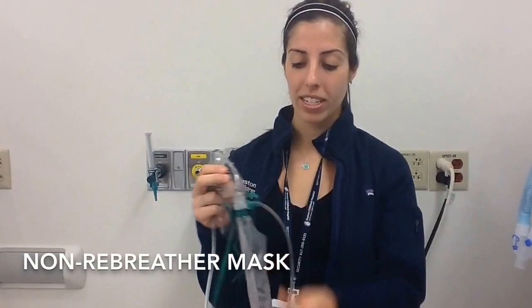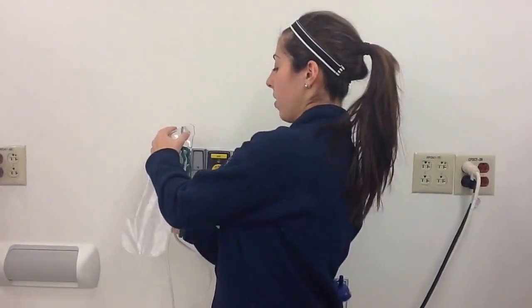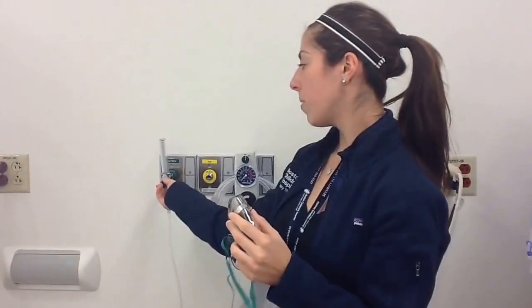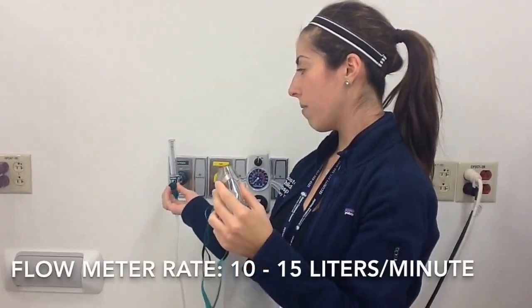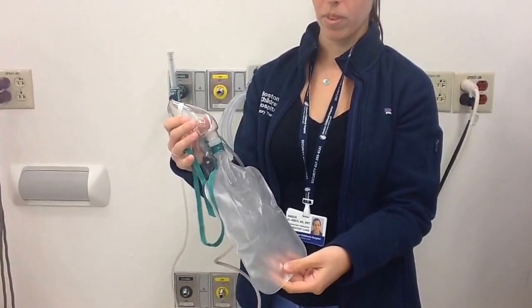Hi, I'm Amber from Respiratory, and I'm going to talk about NonRebreathers. This is a NonRebreather. It consists of a reservoir bag, a one-way valve, and a mask. So this is used to deliver high FiO2 if your patient's requiring 100% oxygen. So you're going to hook it up to a flow meter, and you're going to turn it up to 10 to 15 liters per minute, and make sure that the reservoir bag inflates all the way.